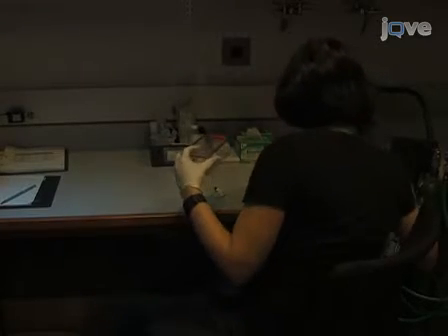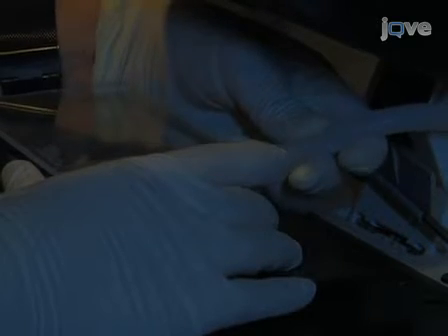To make use of the imaging box, first anaesthetize the animal with isoflurane and apply ophthalmic ointment to the eyes. Attach the isoflurane exhaust from the anaesthesia machine to the front of the imaging box on the outside of the inlet hole. Attach a second tube to the outlet hole of the imaging box. This tube should be attached to the gas filter and then to the vacuum.